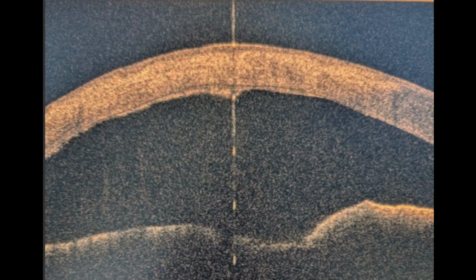Looking at the ASO-CT, we see some changes on the endothelium, like scar tissue formation or posterior collagenous layer deposition in between Descemet's and the stroma, which indicates that the endothelium has been affected by the herpetic disease, but not all of it.